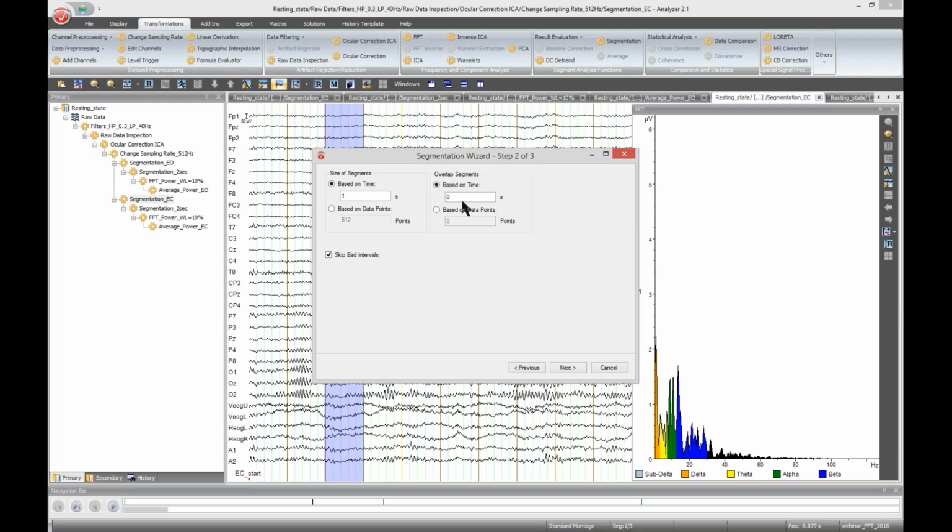But basically in ERP analysis, you would like to compare with respect to the pre-stimulus period, like synchronization or desynchronization, and that could be better analyzed using either wavelets, which is the time-frequency analysis, or using the ERS-ERD technique. But as I said, just to obtain the frequency content of your signal, you can make use of FFT.